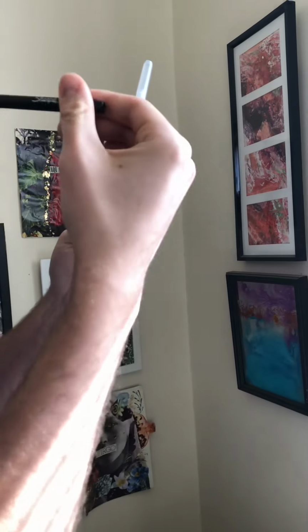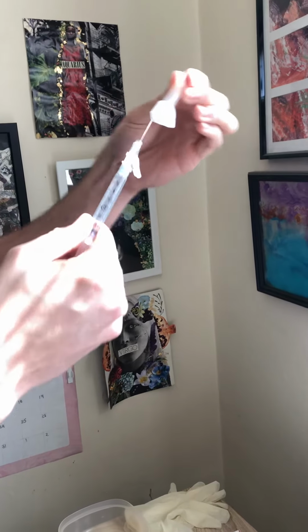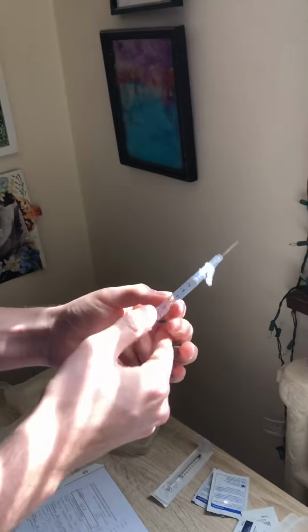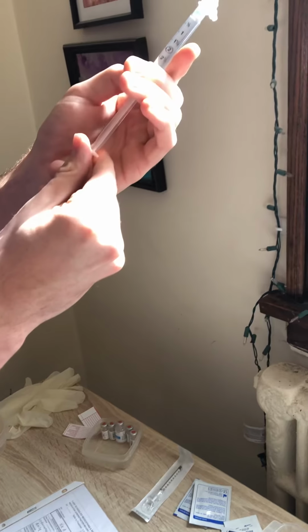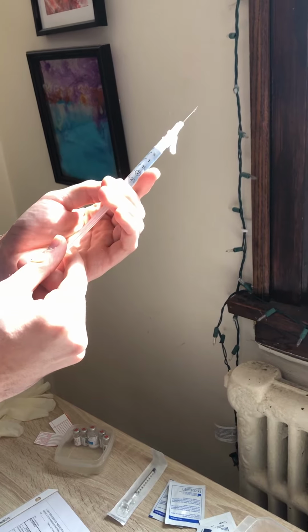And so now I'm going to knock out the bubbles I have here. And now over top of my med waste, I'm just going to get rid of any extra medication I don't need, and prime my needle. Make sure there's no bubbles.